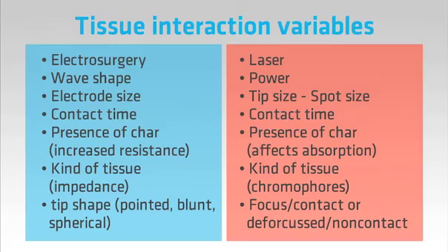We have more technique options available to us. With electrosurgery, we change the electrode tip size and shape. With the laser, we change tip size, the pattern of initiation, and the distance from the target. It's so easy to just change the distance a little to control the laser's effect.